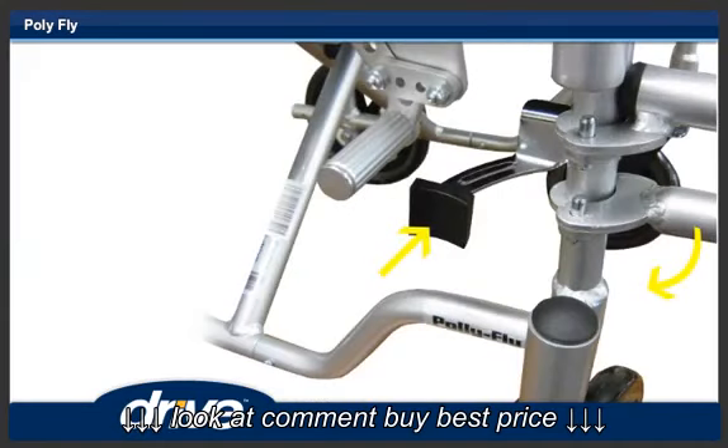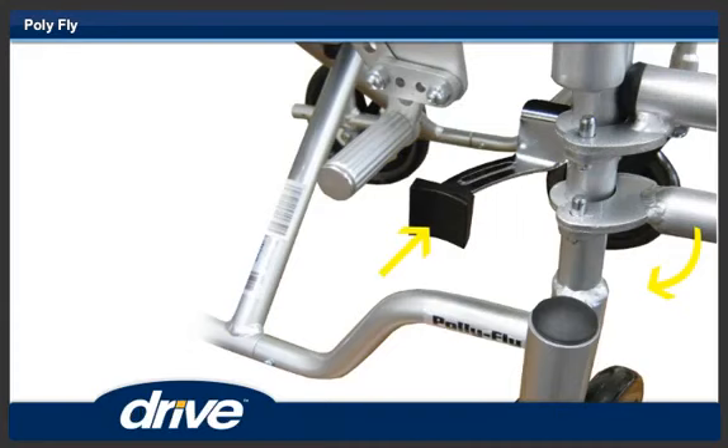Step 7. To remove the footrest, push the footrest release lever in and swing out the footrest.